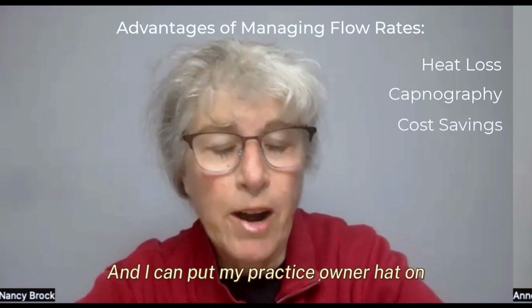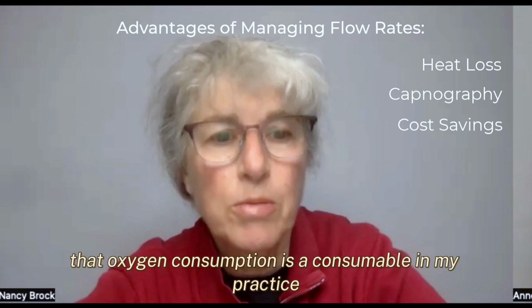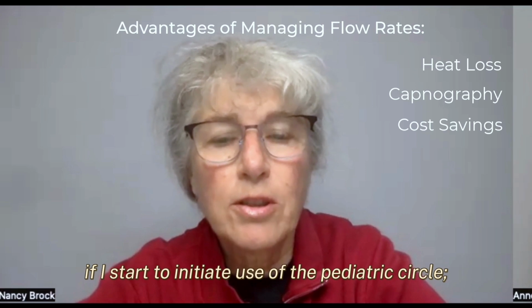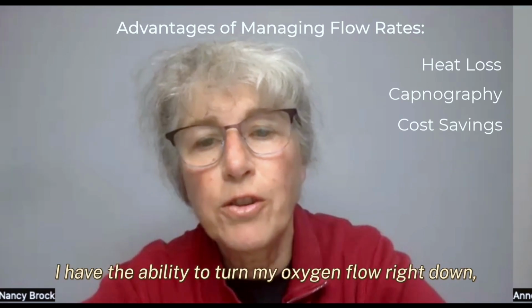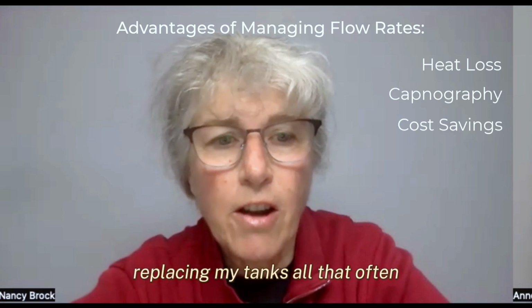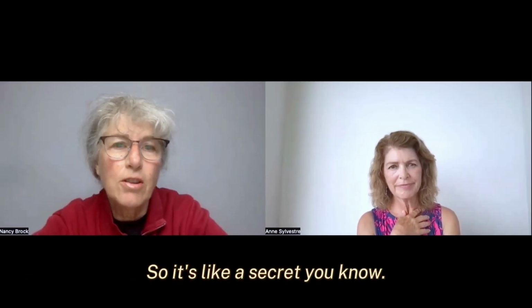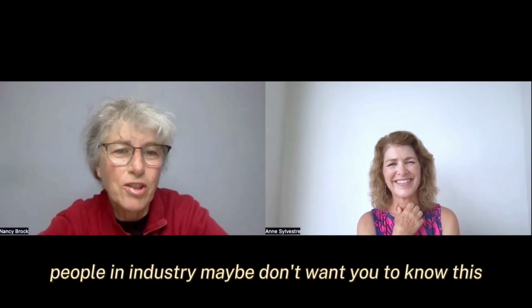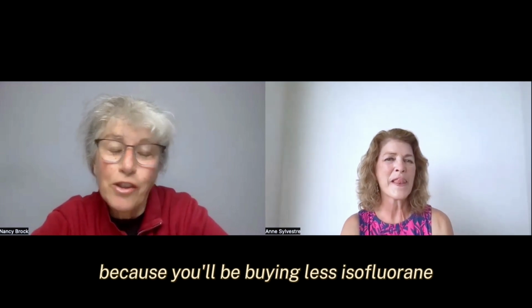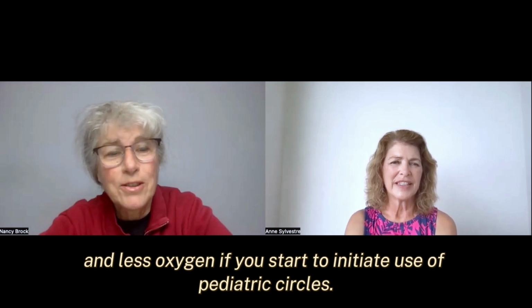As you know, I can put my practice owner hat on and realize that oxygen consumption is a consumable in my practice. And that if I start to initiate use of the Pediatric Circle, I have the ability to turn my oxygen flow rate down, which means I'm not replacing my tanks all that often, and I'm not filling the vaporizer all that often. So it's like a secret, you know. People in the industry maybe don't want you to know this because you'll be buying less isoflurane and less oxygen if you start to initiate use of the pediatric circuits.